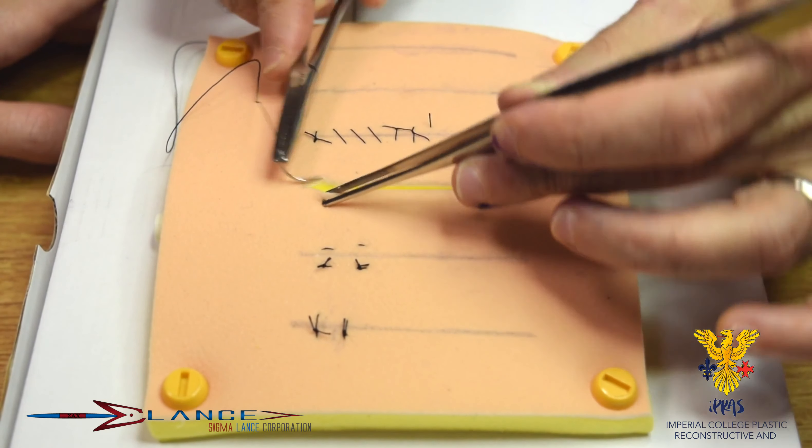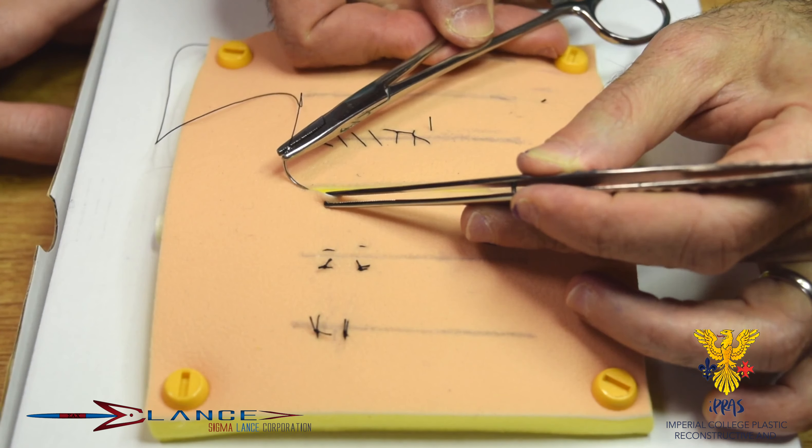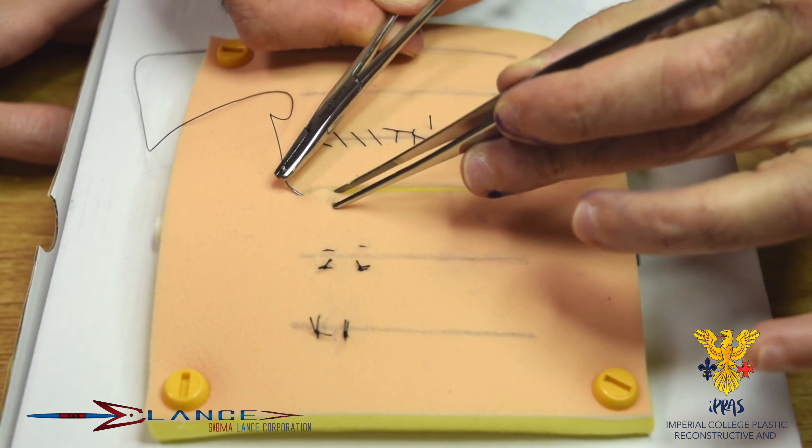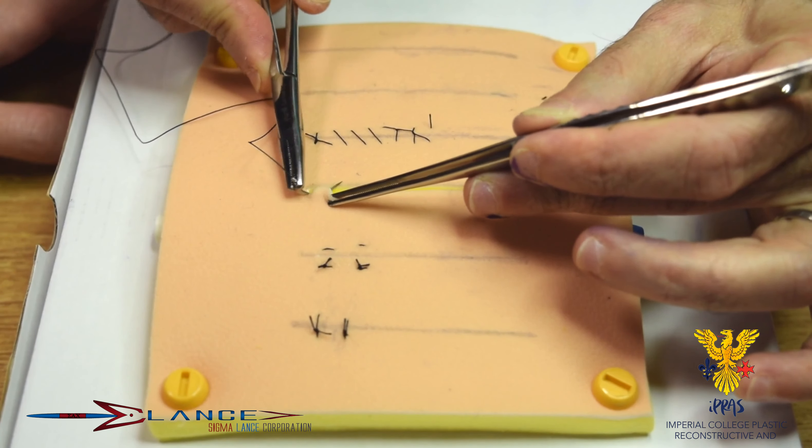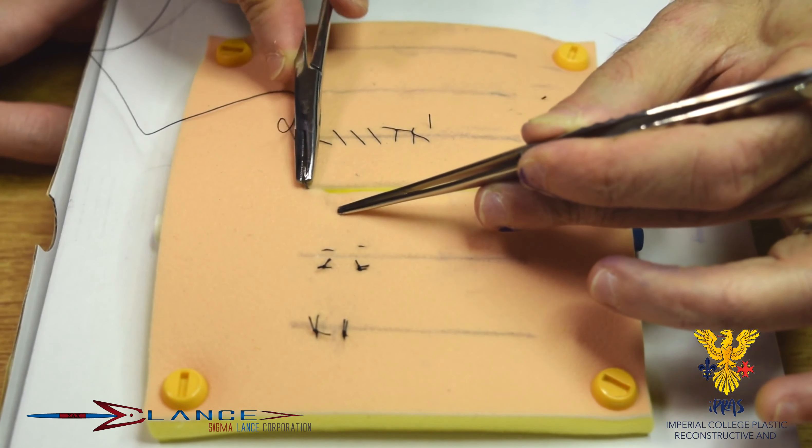Now, as we talked in the last, the subcuticular normally starts with a first stitch that holds the suture in and essentially is pretty much like your horizontal mattress up there.